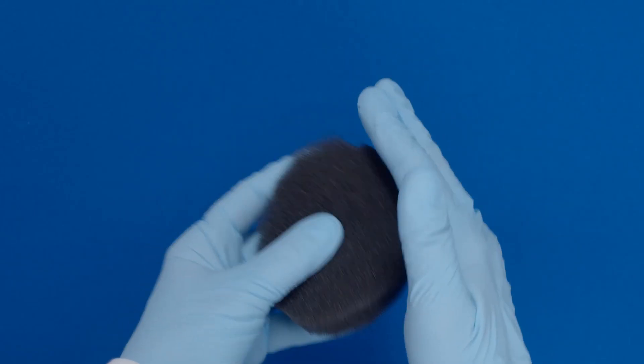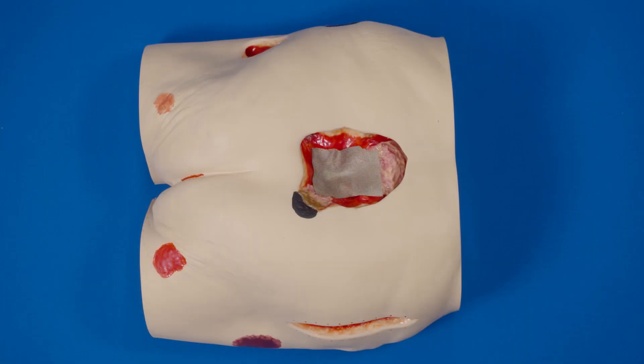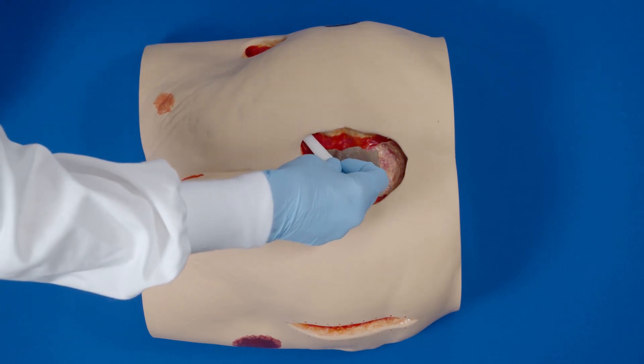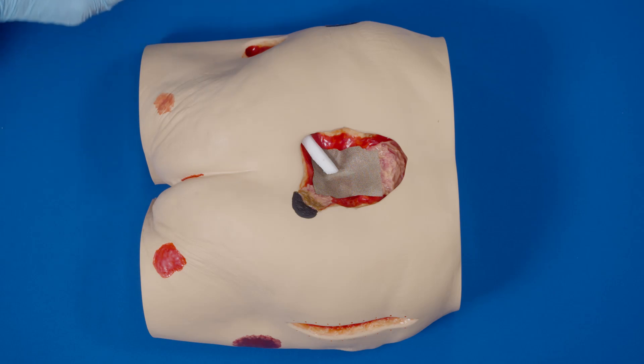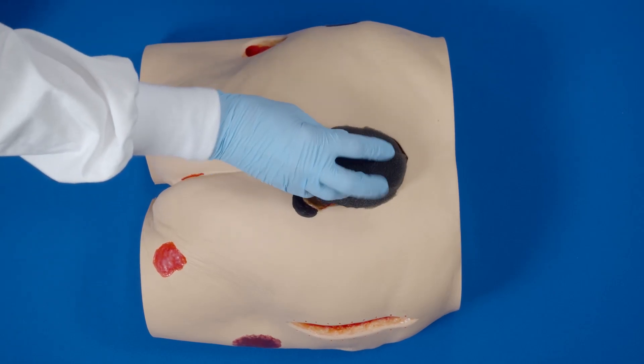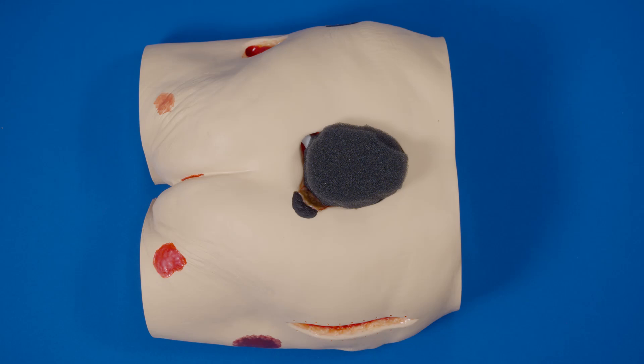Rub the edges of the foam to remove any loose particles. If tunneling or undermining is present, consider using white foam. Cut the white foam one centimeter longer than the tunnel or undermining. Place the white foam in and pull back about 0.5 centimeters. Place the black foam into the wound cavity. Do not tightly pack or force foam into the areas of the wound.